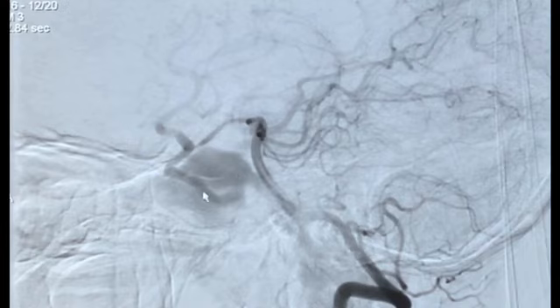And the other option will be to just go across the fistula and put a stent graft, so the fistula is excluded from the circulation. And here we will go with the stent graft and try to place it from here to here. So once we put the stent graft here to here across the fistula, this fistula should not fill anymore.